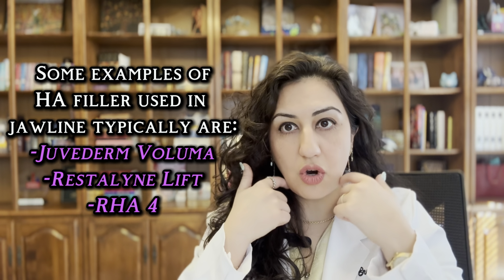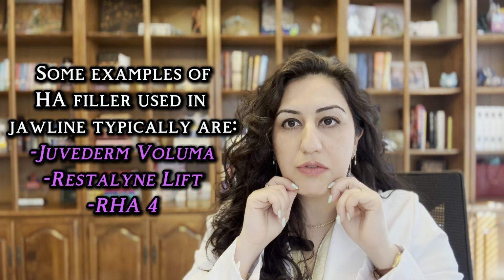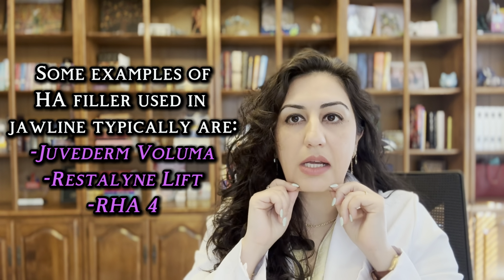After injecting the cheeks, the zygomatic area here, you want to take a look at the jawline, okay? Generally, you'll have patients who will have jowling here, right? Those are the sagging skin that we have here. Now, a note, no amount of filler will ever remove jowls, okay? Filler will only camouflage it if you do it correctly. Rule number one, never inject into the jowl. You will only make it worse. You only inject around it.